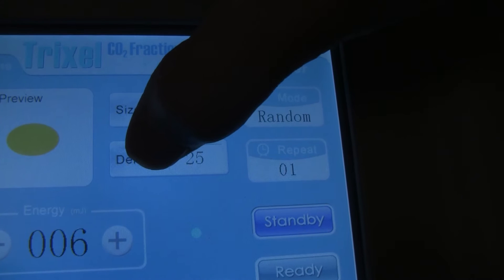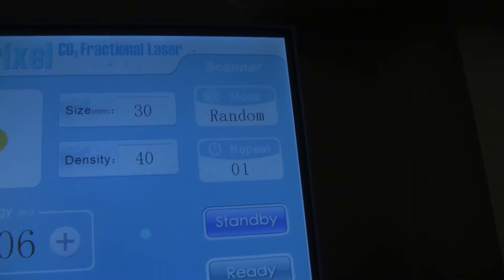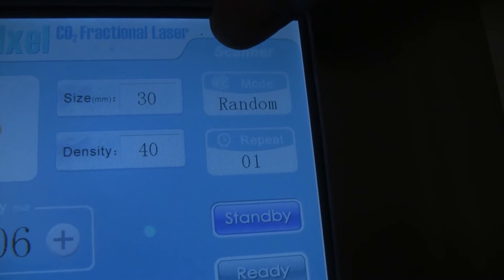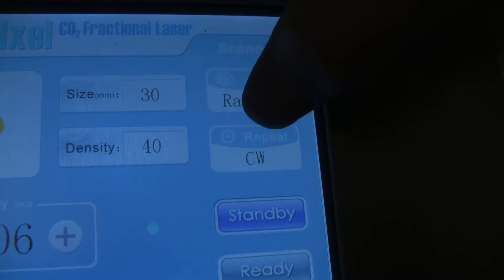The density goes all the way up to 40. There are different modes: there's random, half, and fast. We'll keep it in random for now. Repeat is 1, 2, 3, 4, 5, or continuous wave.